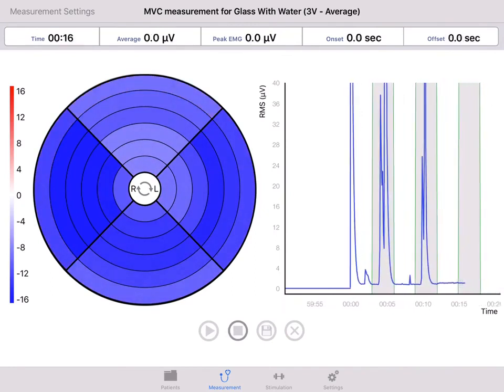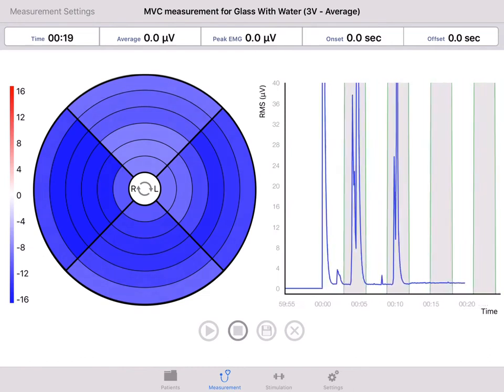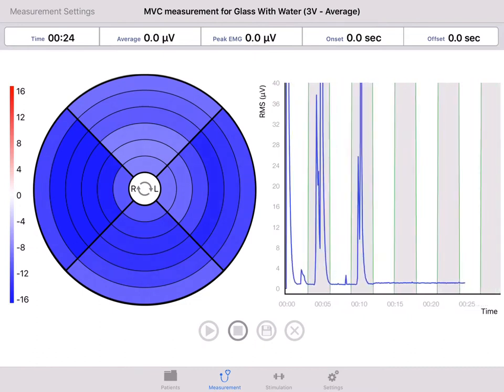In this kind of measurement, white means similar EMG activity as the reference group, blue means less activity, and red means more activity than the reference group.